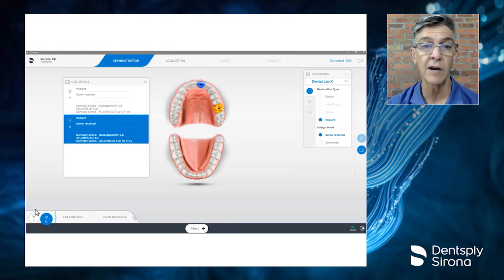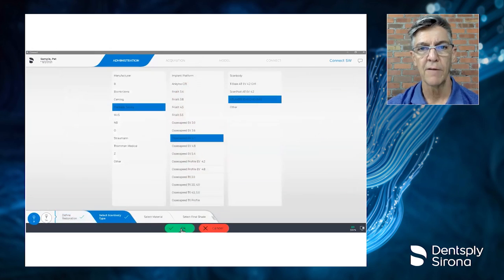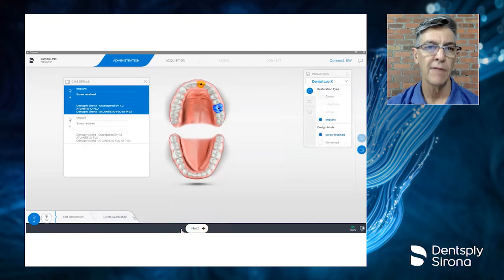But in this case, I've got two different size implants. So I'm going to go back in and make an edit. So I choose my first implant and I edit the size down from a 4.8 to a 4.2, choose that appropriate scan body and click OK. Now I have the appropriate scan body for each implant.